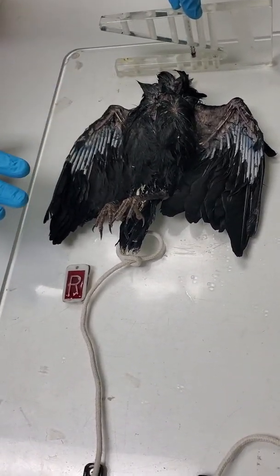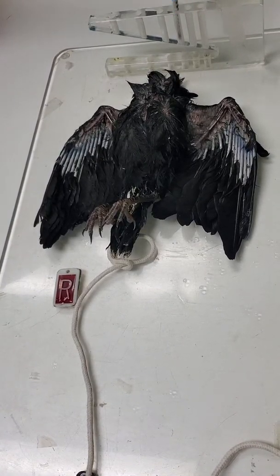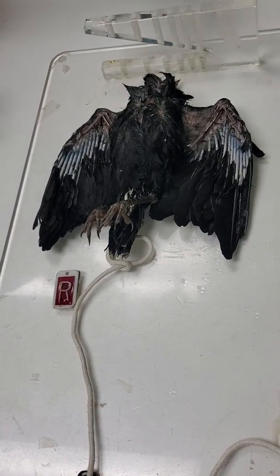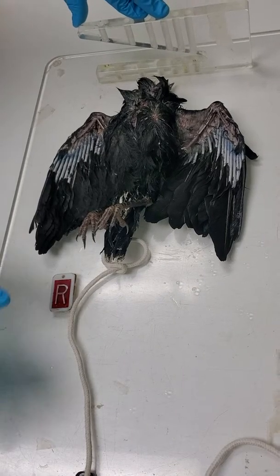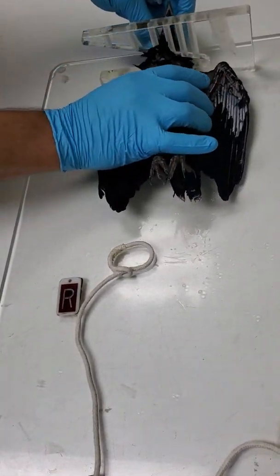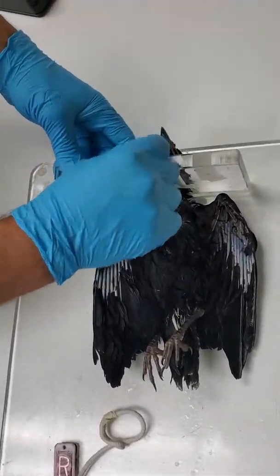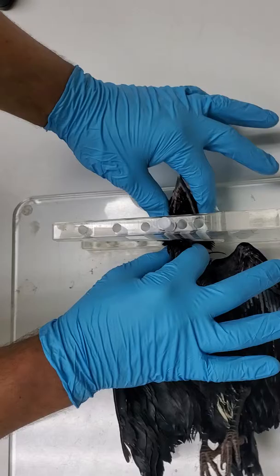I'm going to use a dead crow for this, so that I don't have to worry about the bird being sedated or anesthetized. This is an acrylic board for positioning the bird. I'm going to put the bird's head in this position here, and then put a syringe in there just to kind of hold it still so it can't get out of that spot.